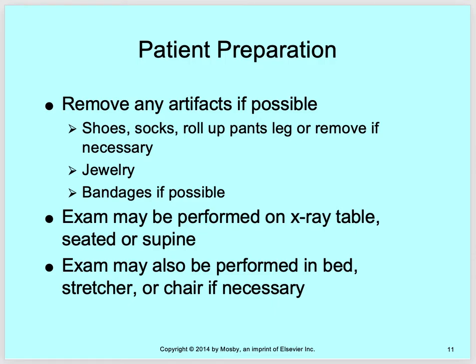Preparation for the patient, always remove the artifacts. Roll the pant legs up or take the pants off, depending on what you're doing. Remove the shoes, remove the socks, jewelry, toe rings, anything like that. And then bandages, if at all possible, try to remove those as well. If you can't remove the bandages, just note in the exam that you were unable to remove the bandages.